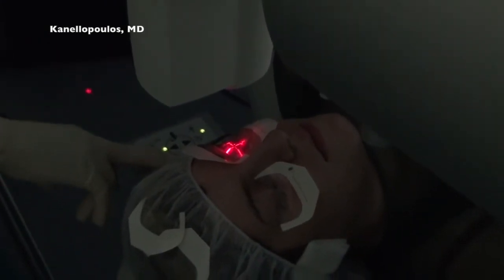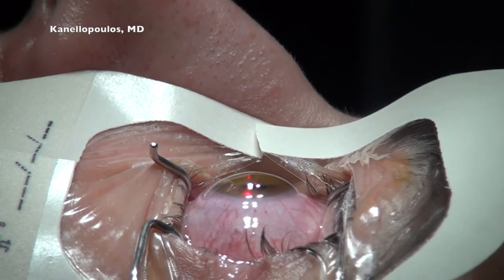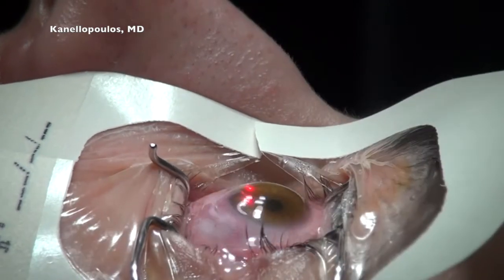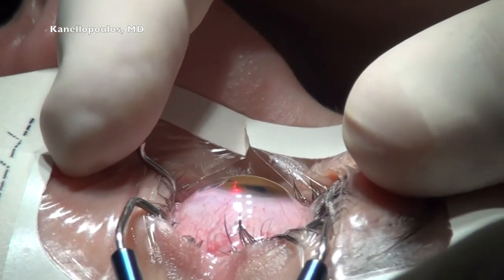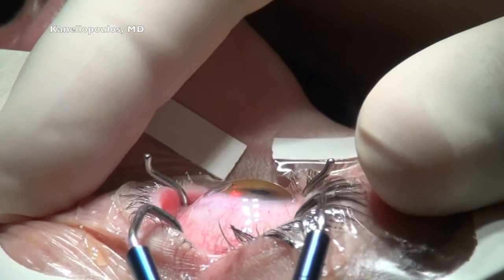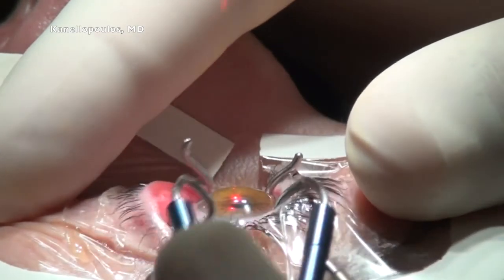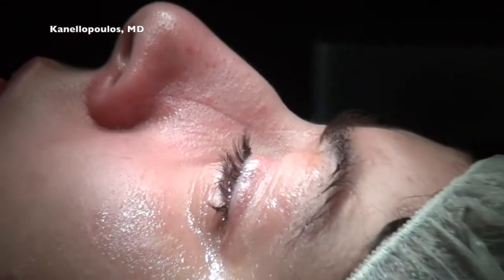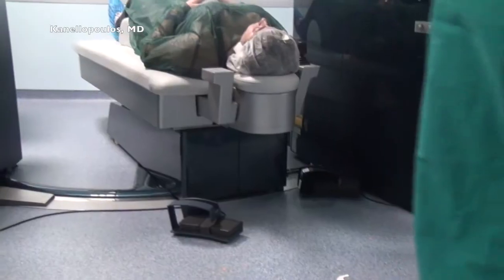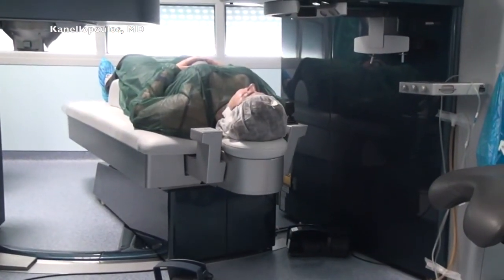You can see it here from the surgeon's view, we'll remove the KXL1 device and then rinse the surface, place a bandage contact lens, which we invariably do for the last 10 years in all our LASIK patients. It increases comfort for the first night. We remove it the first day after surgery, and it also reduces friction between the eyelid and the surface of the flap. So we're removing the speculum very carefully. This is a moment where if the patient squeezes or if the speculum bumps the flap, you may have flap movement. So we're all done.